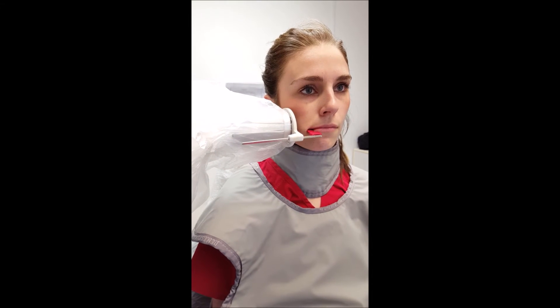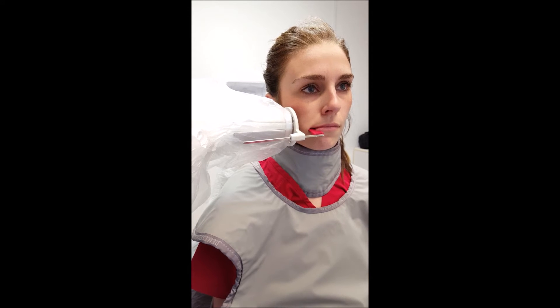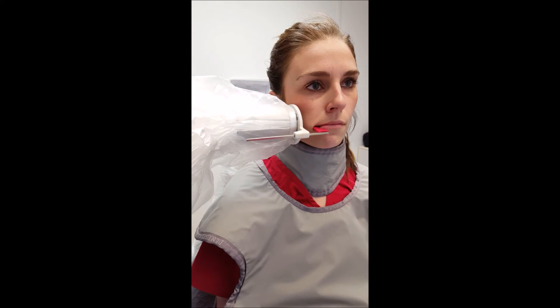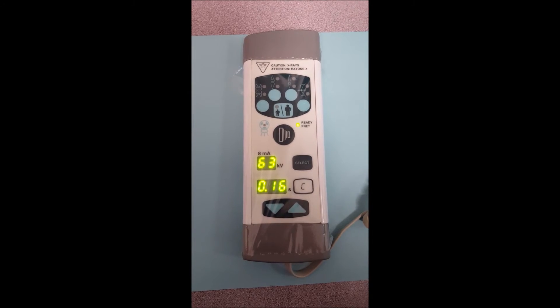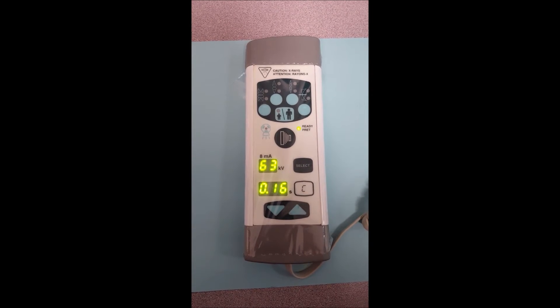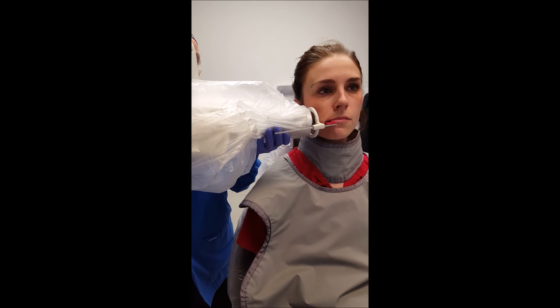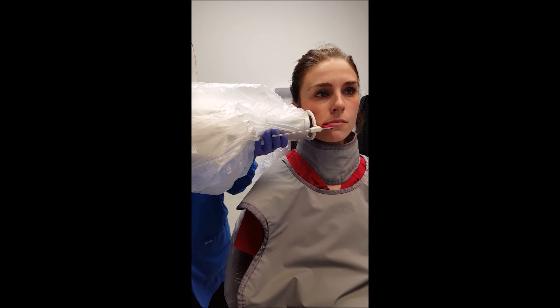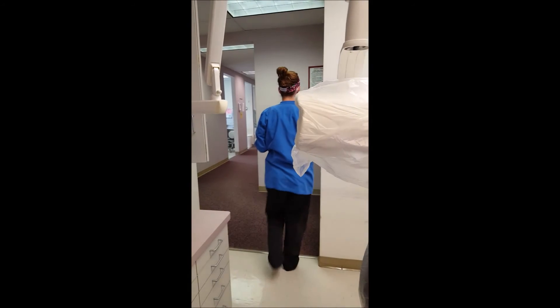The position indicating device, or PID, is positioned at about positive 5 to positive 10 degrees to make sure all structures appear parallel on the maxilla and to achieve better open contacts. The operator will adjust the exposure to 63 KV for 0.16 seconds. After instructing the patient to hold still, the operator will leave the room and then expose the patient.